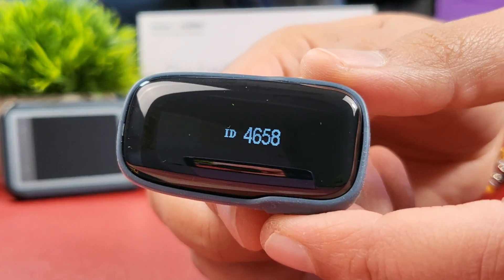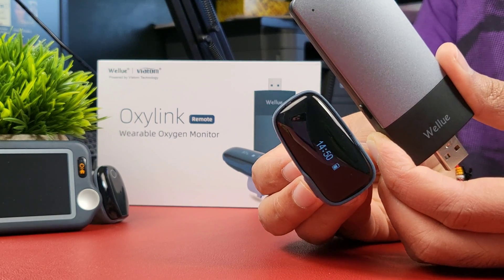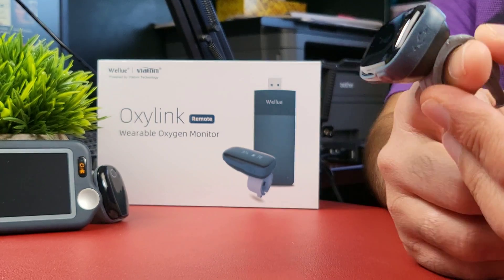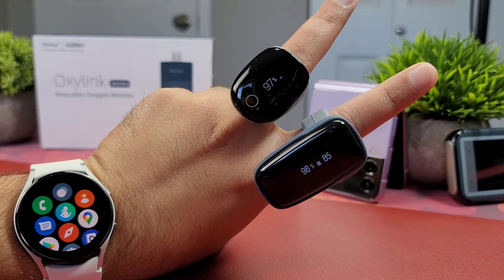This is the OxaLink Remote wearable oxygen and heart rate monitor powered by Viatom technology. With this device you can remotely measure the vital signs of your loved ones anywhere around the globe, and more importantly get instant alerts for any abrupt changes.